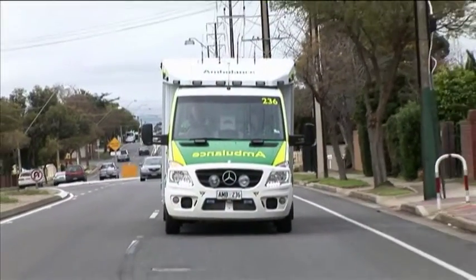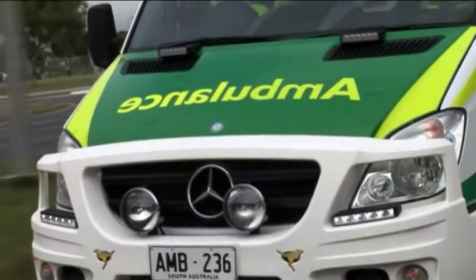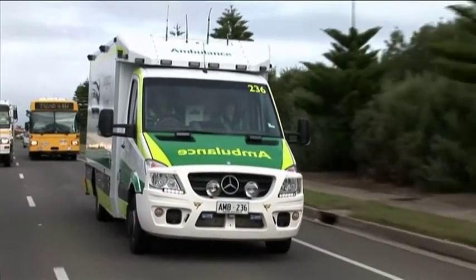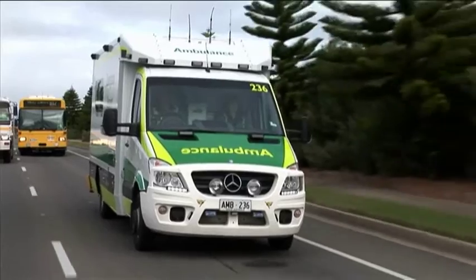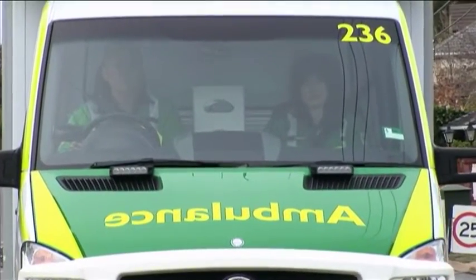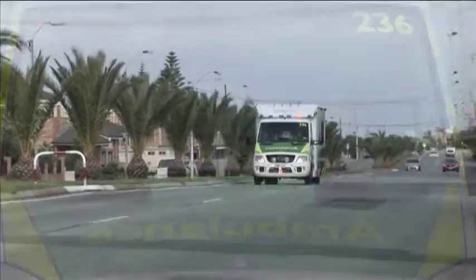Even though we call it our bariatric response unit, it's truly used for both bariatric patients but also complex patients. So we're now using it for CBR patients, intensive care retrieval patients, splinting type patients that don't fit into a normal vehicle.